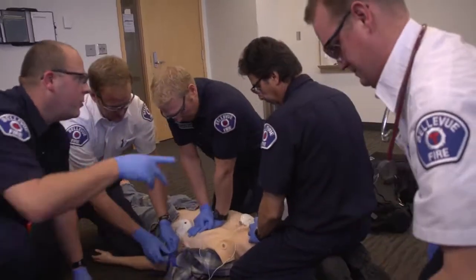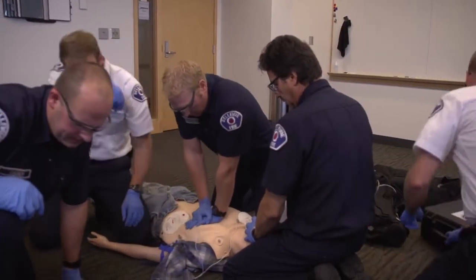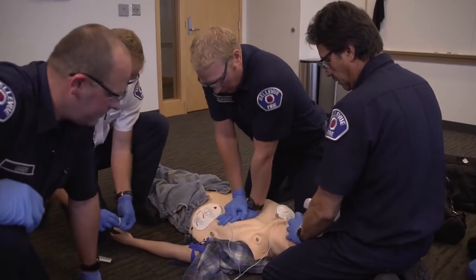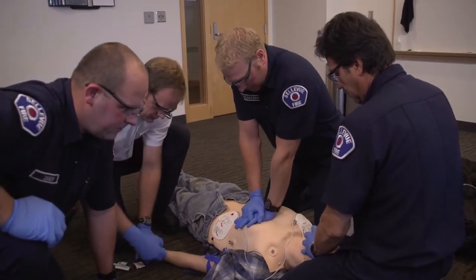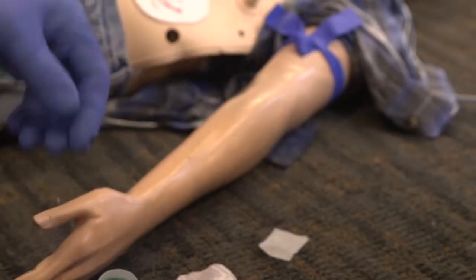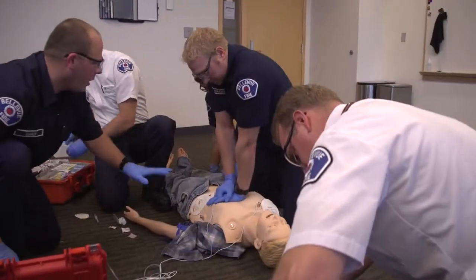After this respiration, Mario, you hop out. 20. 27, 28, 29, 30. Andrew, continue with the compressions. After this cycle, we'll analyze. Remember, we'll hover while we analyze.